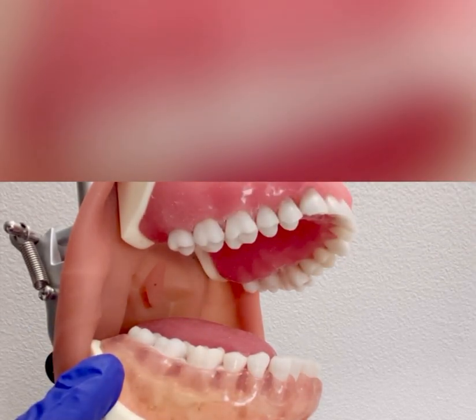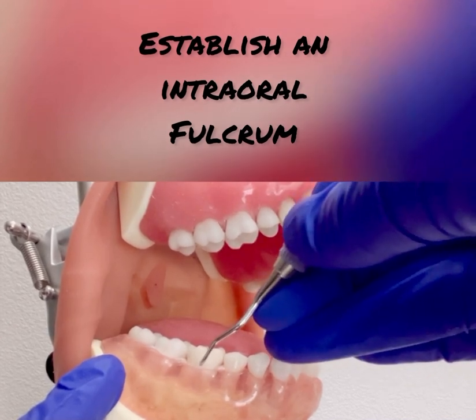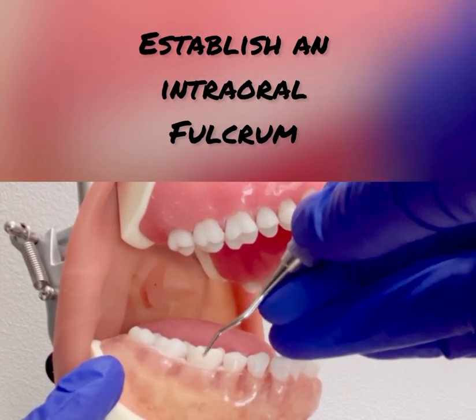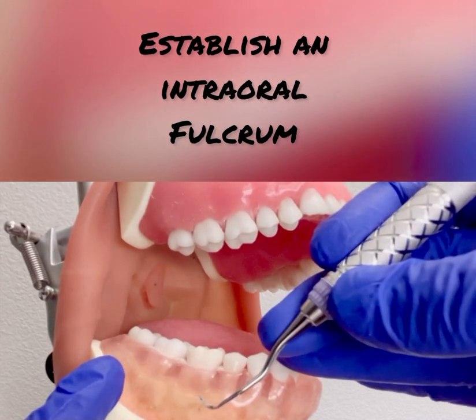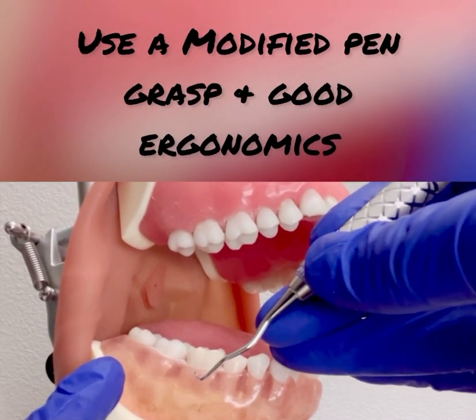After you find the correct working end, establish an intraoral fulcrum either on an incisal or occlusal surface. Use a modified pen grasp and maintain good ergonomics.